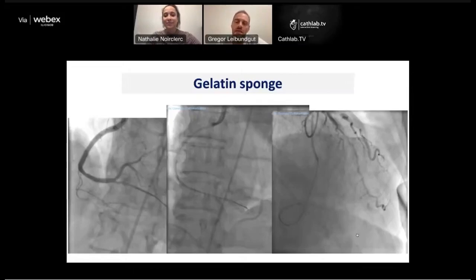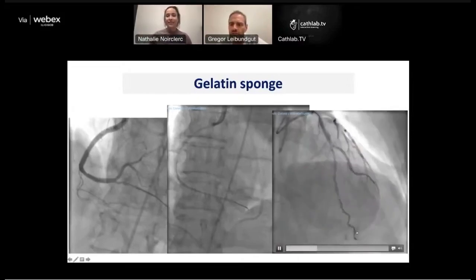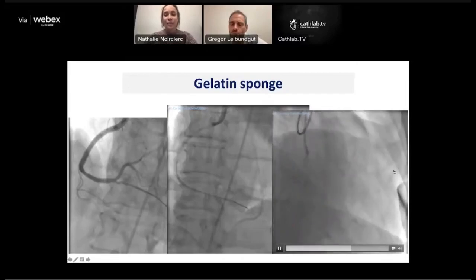So it could be that it's still bleeding from the septals from the left anterior descending. I assume that's why he did this shot from contralateral, to see if there's any collateral filling and bleeding. Yes, that's a very smart idea.